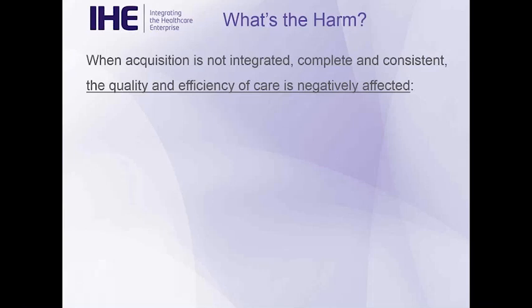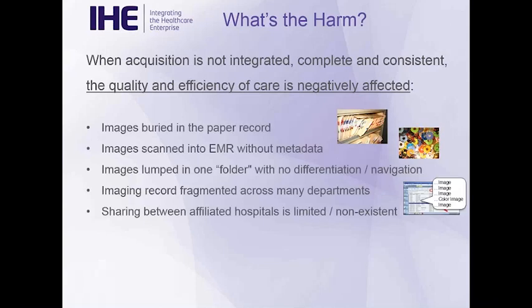In terms of motivation, well, okay, yeah, that sounds nice. What's the harm? Well, if you haven't integrated the acquisition in a complete and consistent way, you're going to be damaging both quality and efficiency. The images get buried off in the medical record, they get scanned in, and without proper metadata, you're not going to be able to navigate them, you're not going to be able to filter them. It's like trolling through your iPhone. I think I took a picture of this, like, 2 months ago. If you want to be able to pull things up in a patient encounter, you don't have 10 minutes to go wandering through these folders and folders of files. Oh, that looks like skin. Nope, that's not the right one.